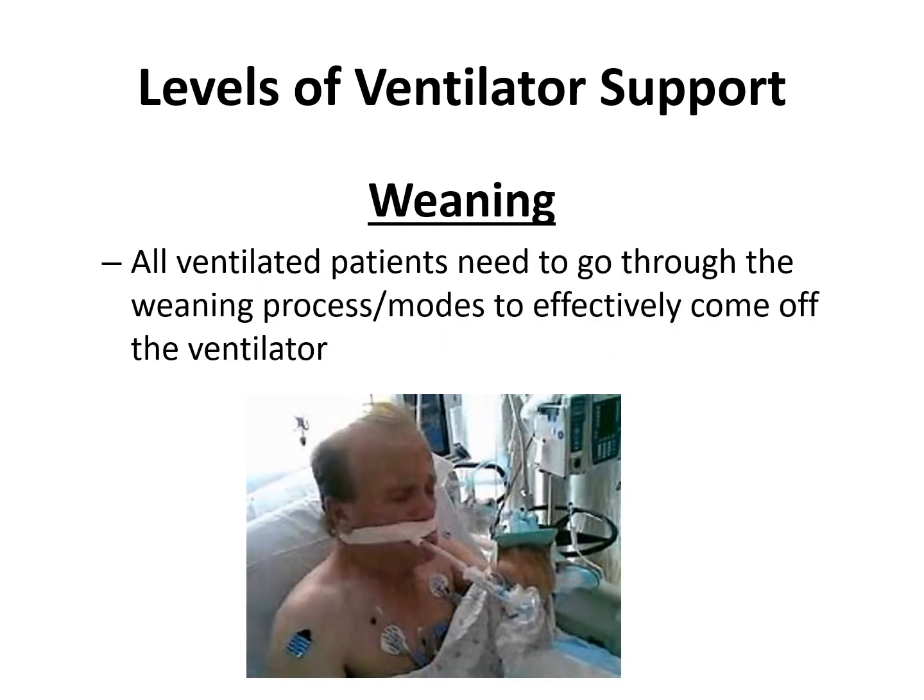Now the weaning modes, this is a support that all patients will need to go through, a weaning process, to effectively come off a ventilator. So it's slowly pulling off full support when you go to intermediate support, and weaning is not completely extubating them, but allowing the patient to practice breathing on their own with a little support.